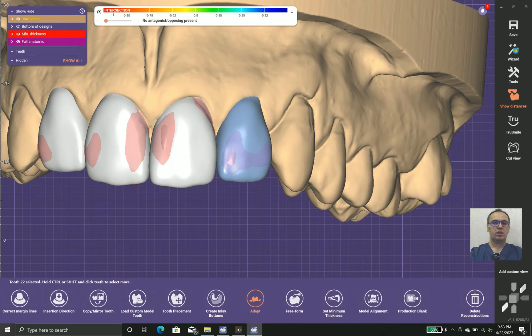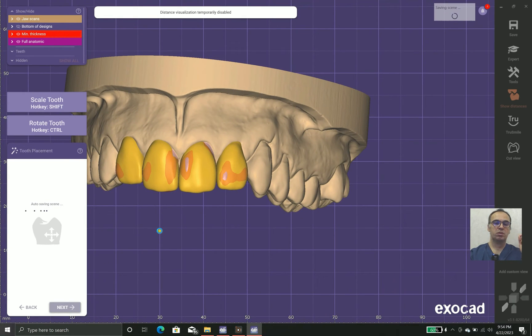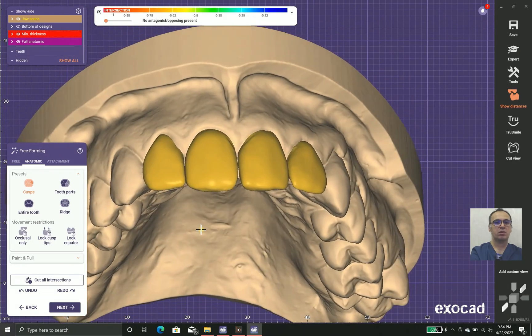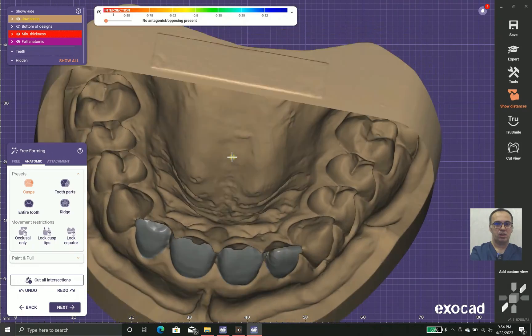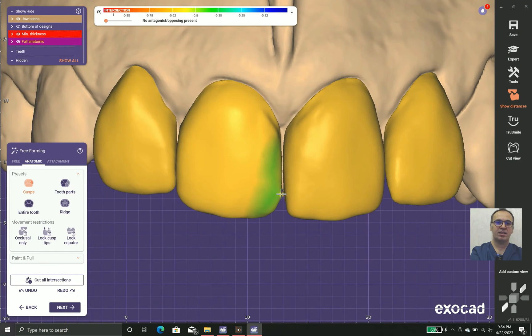Now we go back to wizard mode. Sometimes you need to work in expert mode, sometimes in wizard mode, but keep in mind that both modes work together. The margins look good, but the tooth alignment needs a little adjustment — small alignments.